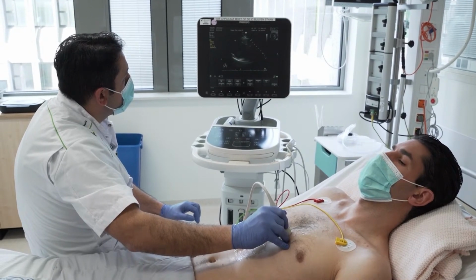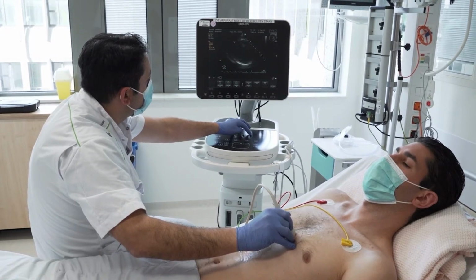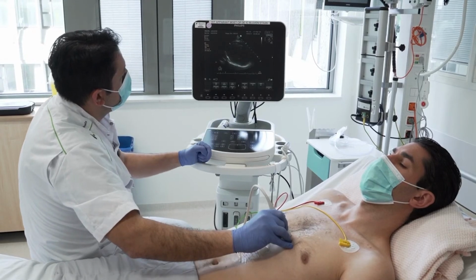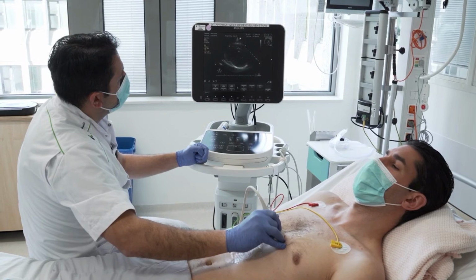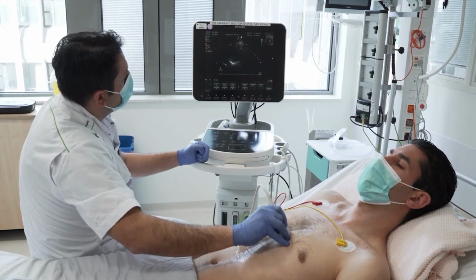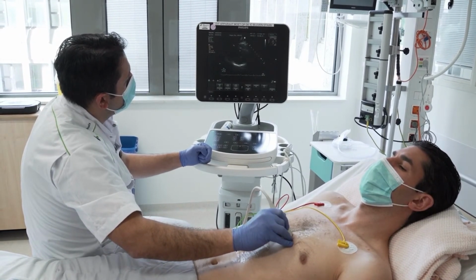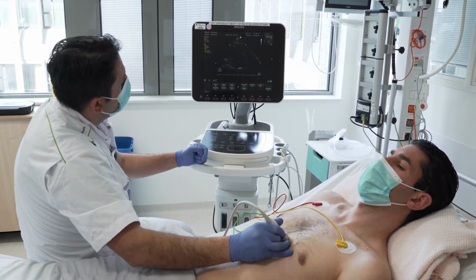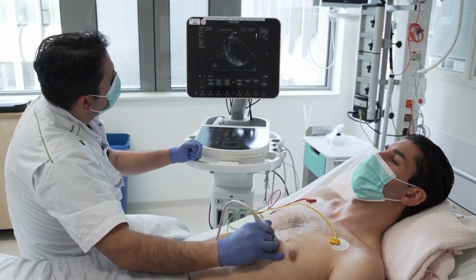So we now make a cross section of the heart. We shall play a little bit with the gain. It's always important to have optimal gain. And you can walk through the left ventricle and right ventricle from the apex. This is the apex. And then Sakir will walk by tilting a little bit and show us the mitral valve. This is, I think, the mitral valve.